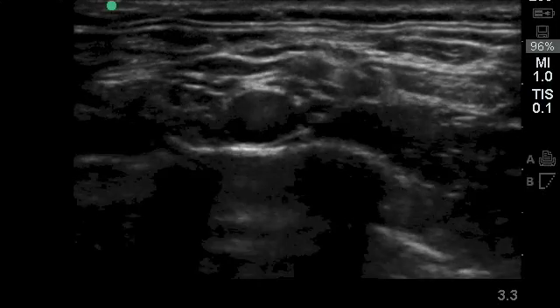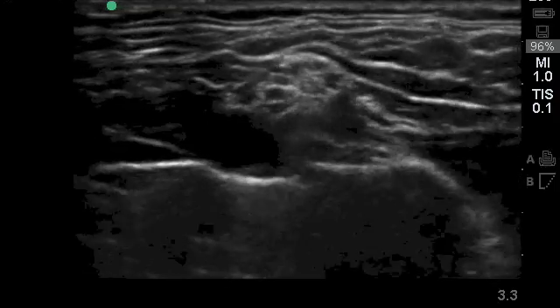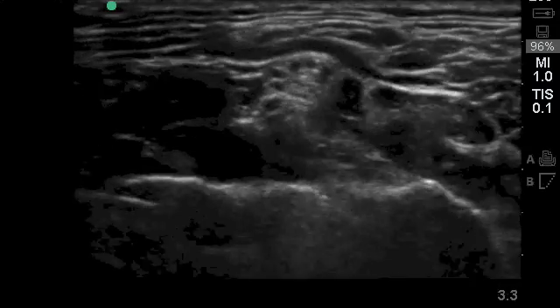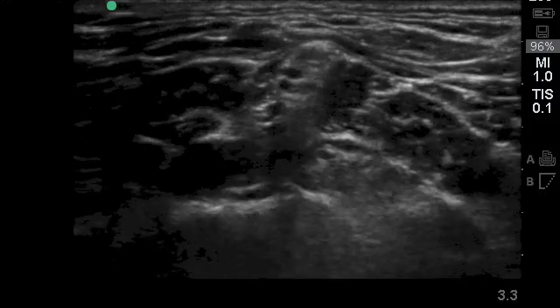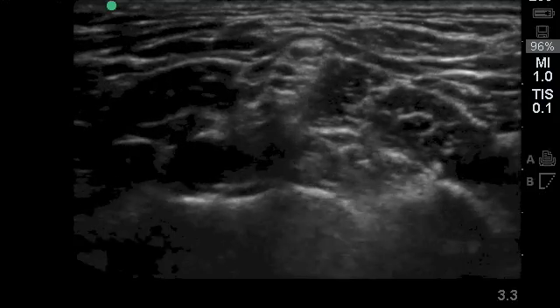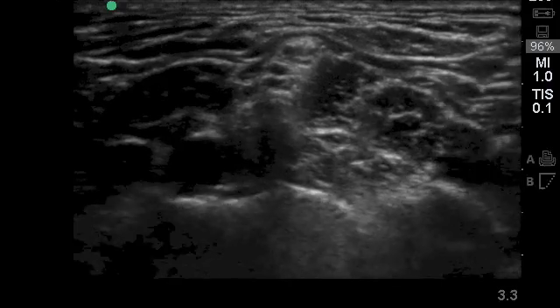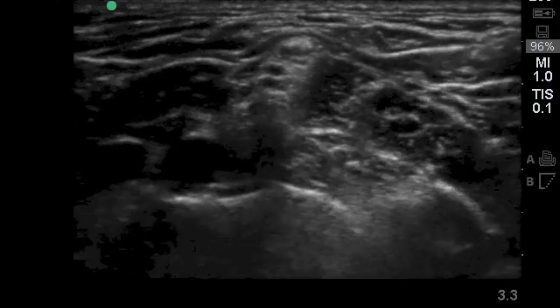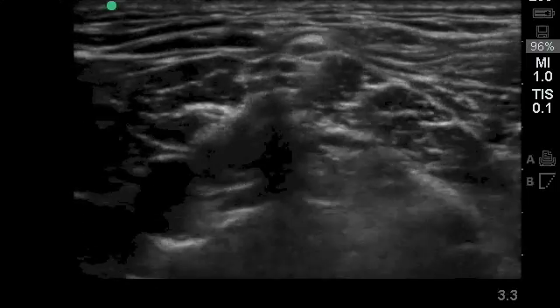This ultrasound video shows the brachial plexus in the supraclavicular approach next to the subclavian artery. As we scan up the neck, you see the brachial plexus lining up in the interscalene groove in the typical red light, yellow light, green light formation in a north-to-south direction, with the scalene muscles on either side. From the right, you're going to see a needle coming towards the plexus — this is the local anesthetic being delivered for the subcutaneous infiltration.